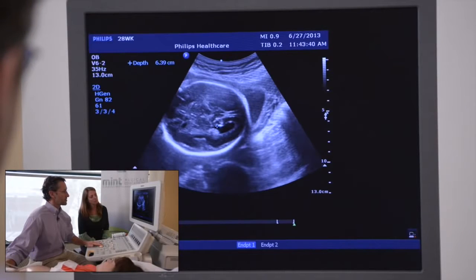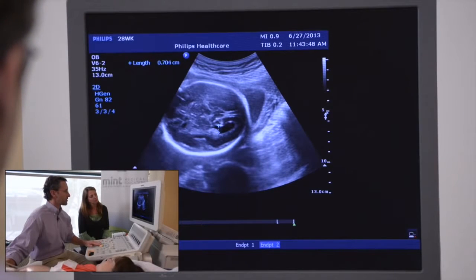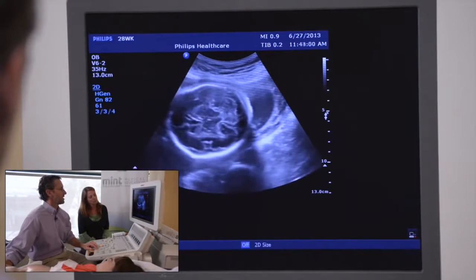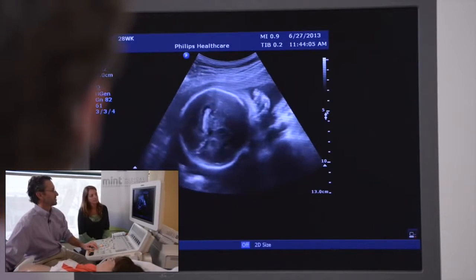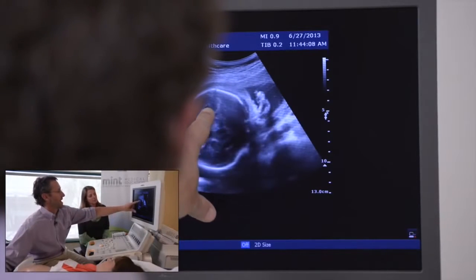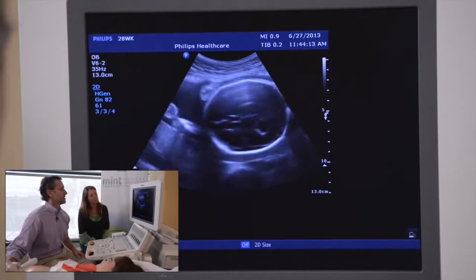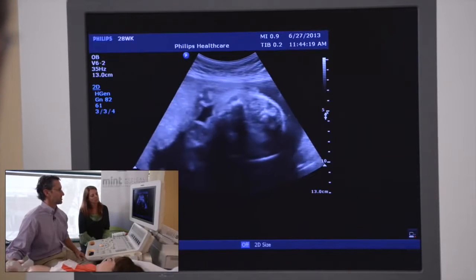And I'm not going to do a lot of measuring right now, but I'm just going to show you to measure the lateral ventricle. We want to measure right across this area, which is called the atrium of the lateral ventricle. And it's right across where the choroid starts to curve in here. And I apologize, this isn't the most perfect picture of a ventricle, but that's basically how you want to measure it. If you do need to look at the upside ventricle, you can swing around and make some tricks and actually come in from the back, and then you can see that there is in fact a ventricle up there, but it's not necessary to do that in every case. We assume symmetry unless there's a reason to assume otherwise.